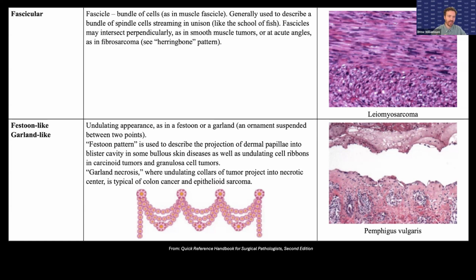For me, this was helpful because a lot of these pathology jargon terms originated back in the 1910s and 20s, and were maybe in more commonplace use outside of pathology, but nowadays I've not used the word festoon or garland very often in my life. So it's helpful for me to see a garland or a festoon. But this is, again, how we learn pathology and how we understand what is in these pathology images.